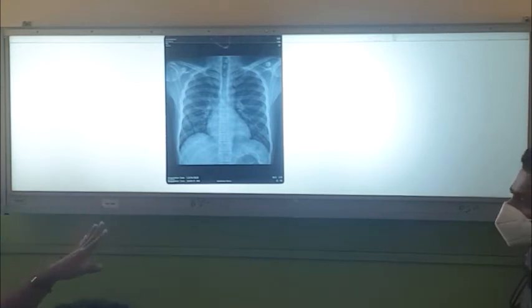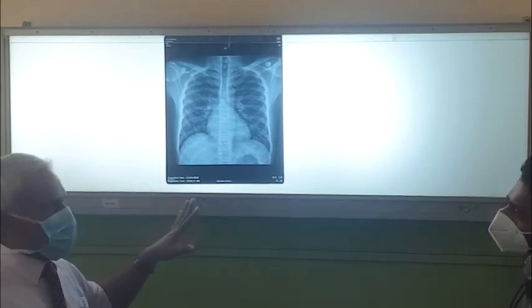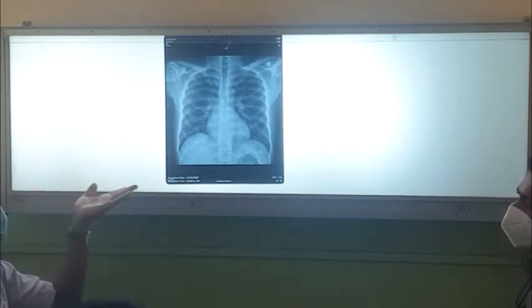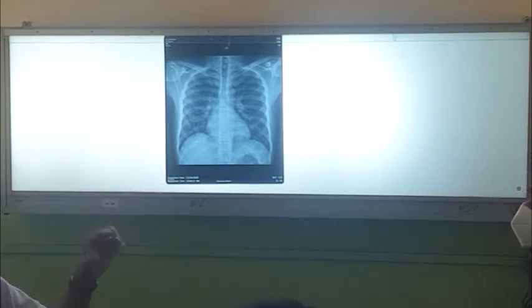Now on antiretroviral therapy. The other possibility that you have to think of is pulmonary embolism. The X-ray will be normal looking, the patient is hypoxic, dyspneic, and the X-ray looks normal, but they are hypoxic. So normal looking X-ray with hypoxia, think of acute interstitial pneumonia, Pneumocystis carinii, and pulmonary embolism, right? And also miliary TB, sometimes at a very early stage the X-ray may look normal, but later on they will develop miliary shadows 2-3 days later, right?